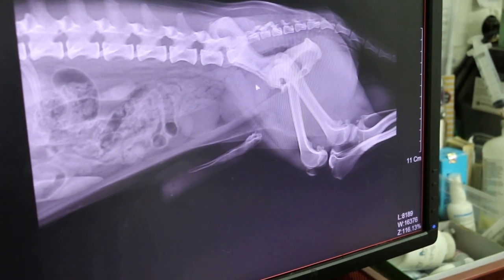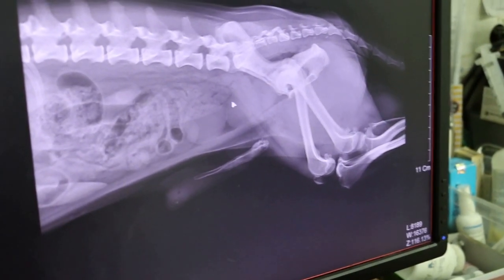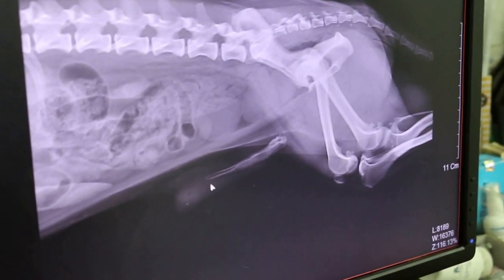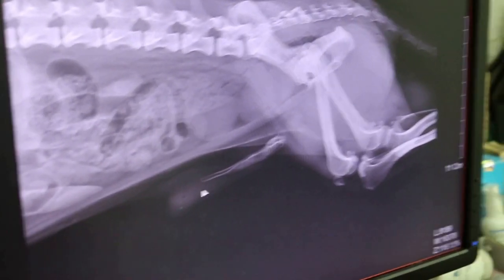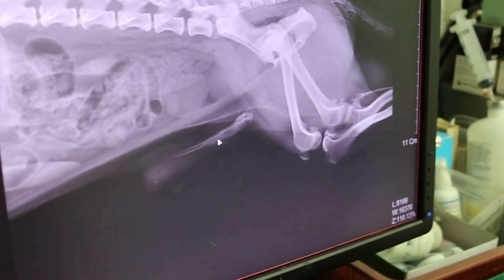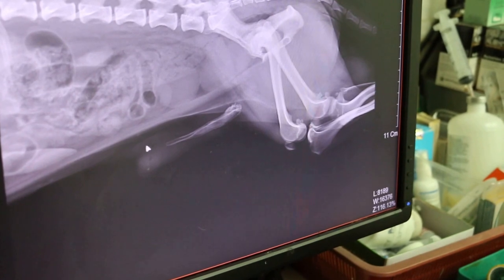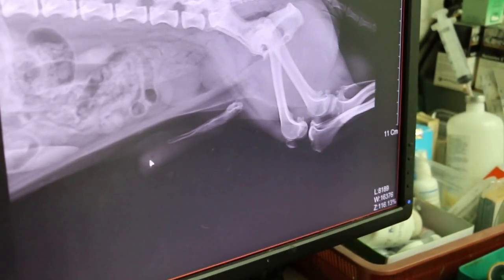The bladder and prostate hypertrophy are due to old age — the prostate is very large. Now we can see that the dog has been licking his foreskin, the prepuce. This is why it's swollen there, because of the dribbling of bloody urine which is irritating to the dog, so the dog keeps on licking it.